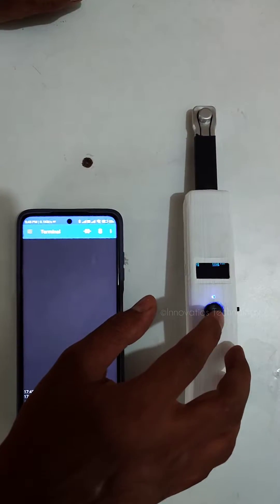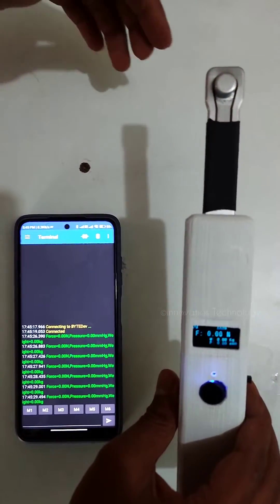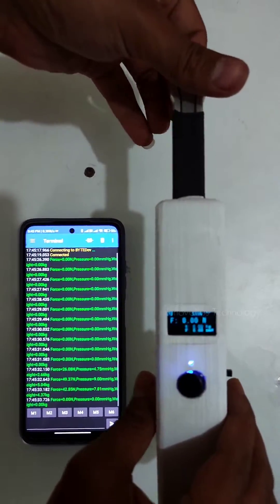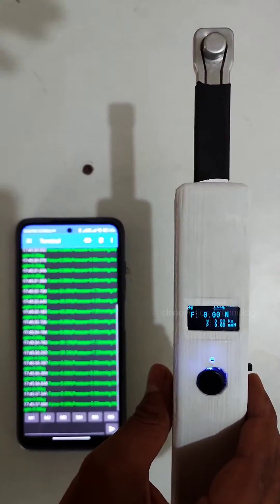Whenever you want to measure, press the button and it will start in measuring mode. You can then start your operations and the data will come in simultaneously.